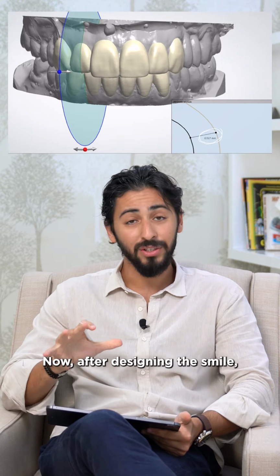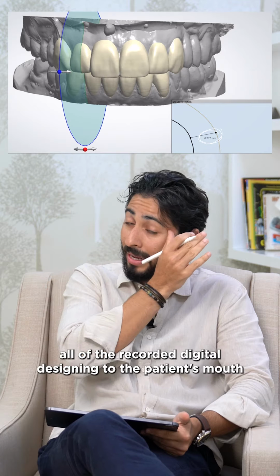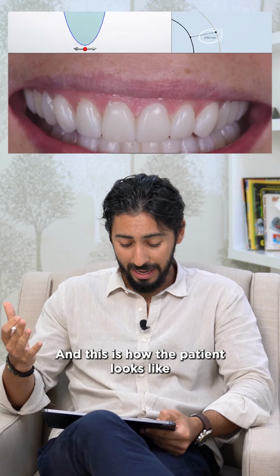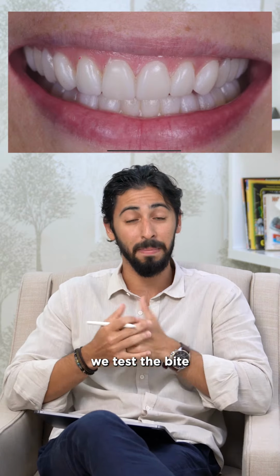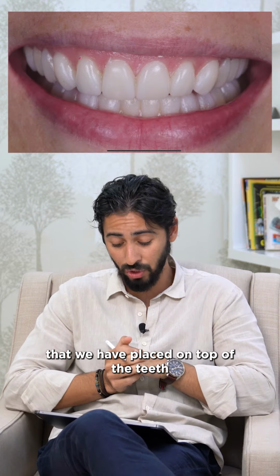Now, after designing the smile, we transfer all of the recorded digital design to the patient's mouth through what we call mock-up temporaries. And this is how the patient looks. And of course, with these temporaries we test the phonetics, we test the bite, and most importantly, we test the thickness that we have placed on top of the teeth.